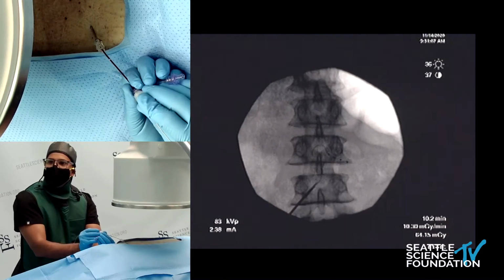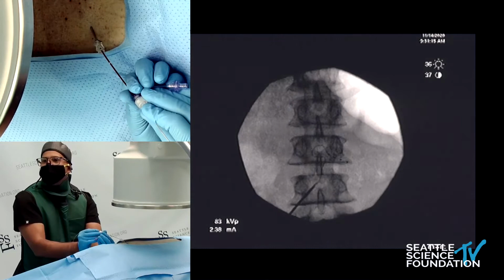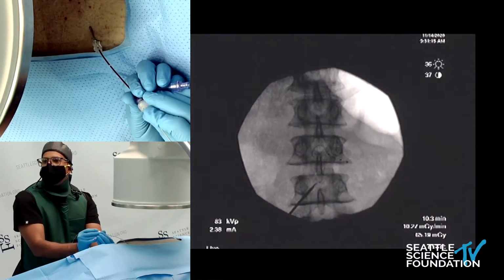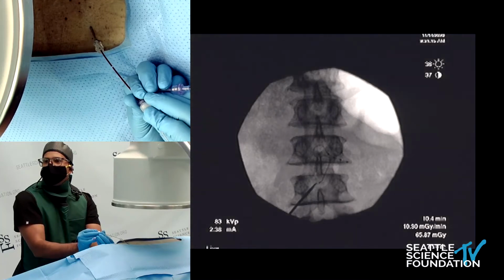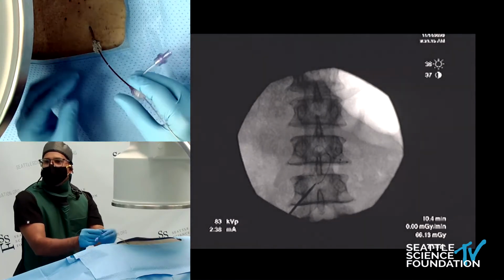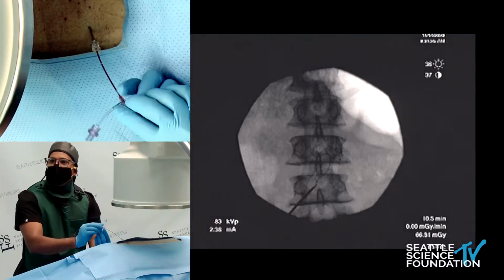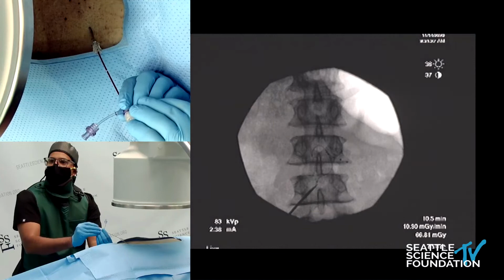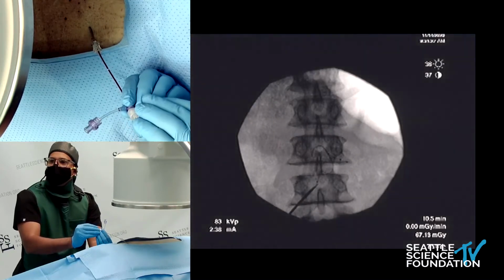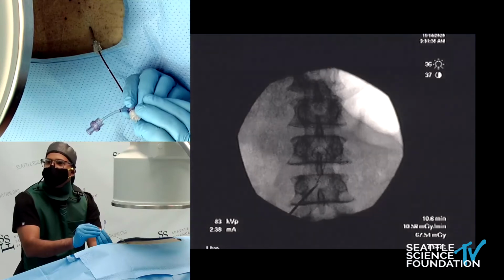And there we go. We got a little loop there. There we go. And we're seeing a little bit of that caudal loop here. And now let's see if I can just finish it off with a little. And there's a lot of give and take here when it comes to this stuff. Let's see, that cephalad really crossed over, so I don't love that.